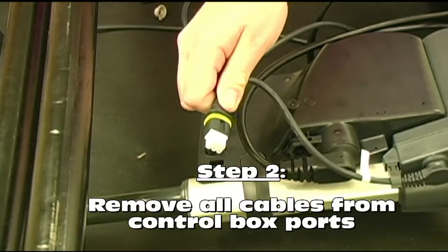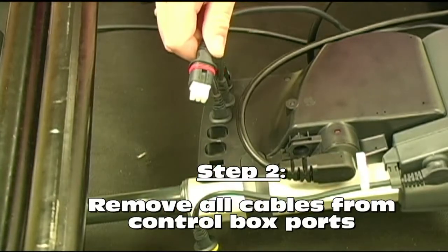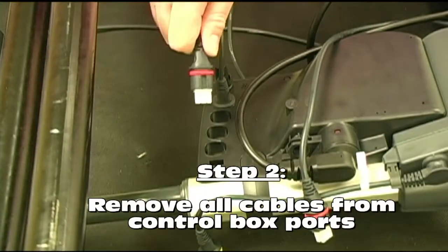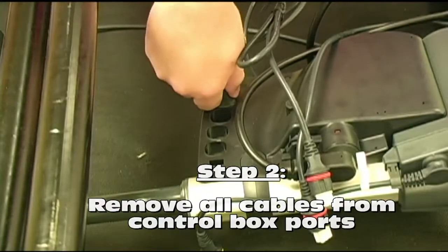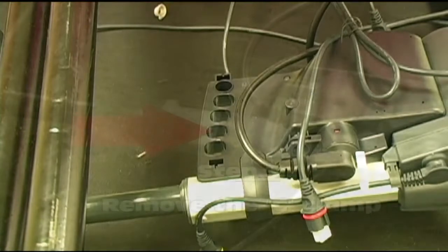Depress the two tabs with your screwdriver as seen here and remove the plug retention clip. With the plug retention clip now removed, you should be able to easily remove each plug from the ports in the control box. Be sure to pay attention as to which plug you're removing and the associated port it was plugged into. This information will be helpful when you're ready to plug the wires back into your new control box.